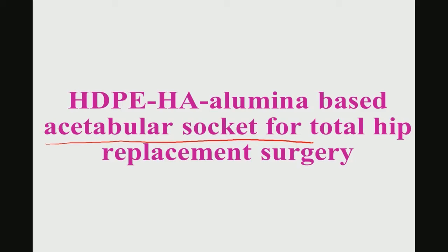In this module I will be discussing how to develop a biomedical device prototype. Just to give an example, I will discuss results from our own research, that is acetabular socket development of high density polyethylene, HDPE, hydroxyapatite and alumina based materials, that is what we call a hybrid composite. Why hybrid? Because it contains both the ceramic phase and polymer phase together.